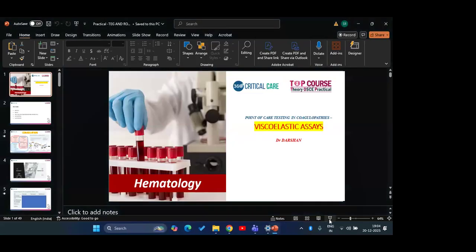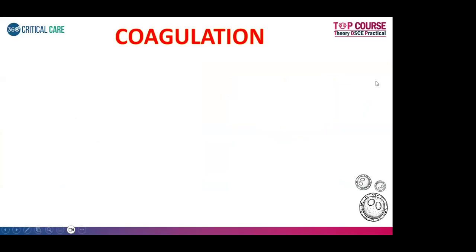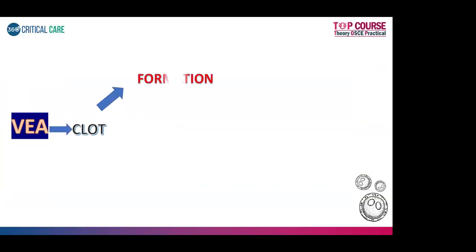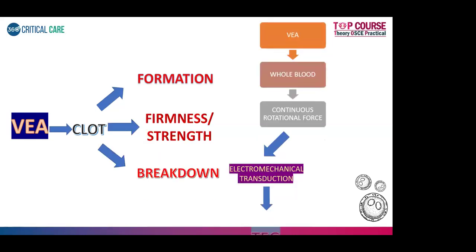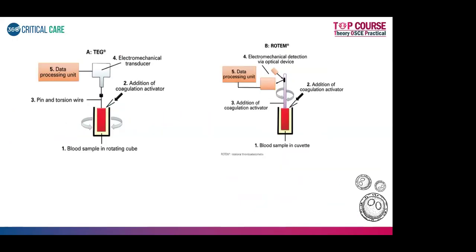Sir, I wanted to ask, what if the CT is prolonged in EXTEM? CT is prolonged in EXTEM. Okay. So if CT is prolonged in EXTEM, you see INTEM as well. Both have to be seen. This is not only one thing. EXTEM, what does it tell you about? It just adds tissue factor to start the clot formation. Everything else it will assume to be normal. It's just going to add your tissue factor.